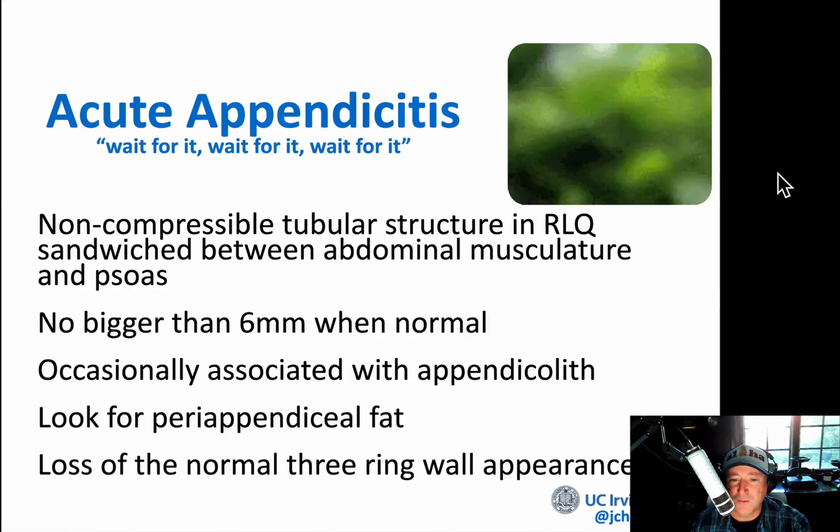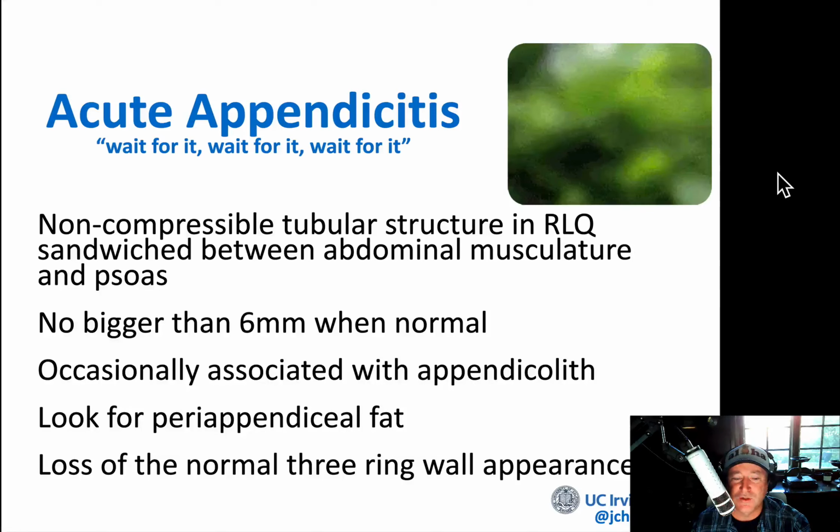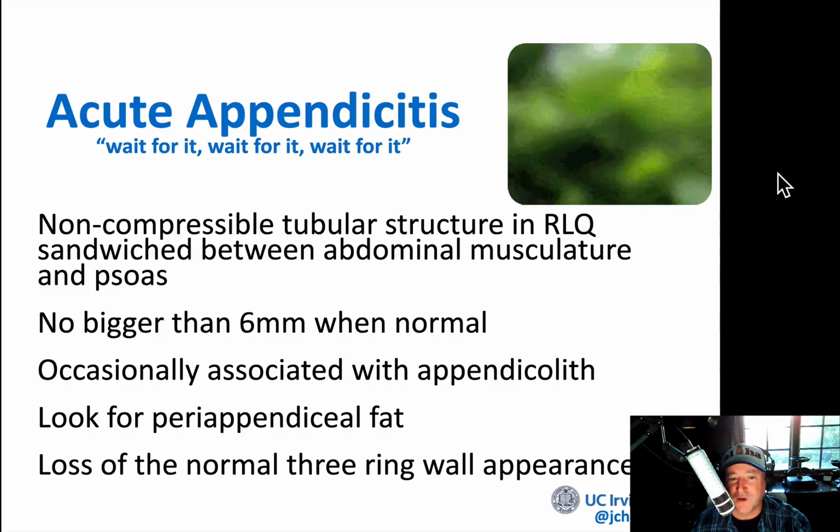It's probably the most amount of time I might ever spend doing an ultrasound. I spend maybe 5-6 minutes sometimes just doing these graded compressions. And I know that's a long time to be doing an ultrasound, especially when you're working a busy shift. Depending on all of your other responsibilities in that moment and the situation and the line for CT scan, maybe this makes sense in your situation to do it yourself.